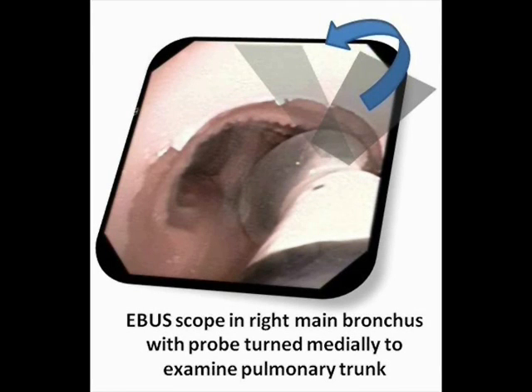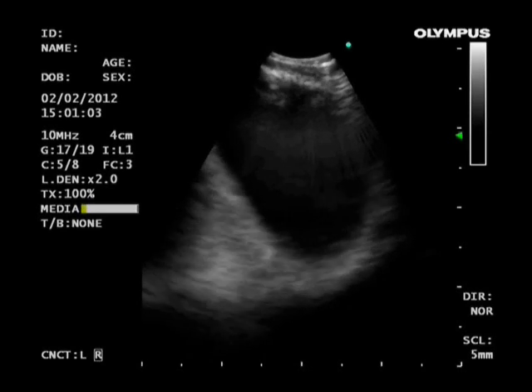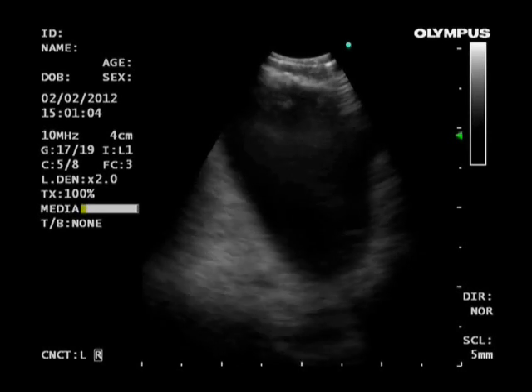With the scope near the main carina and rotated anteromedially, the pulmonary trunk is inspected.